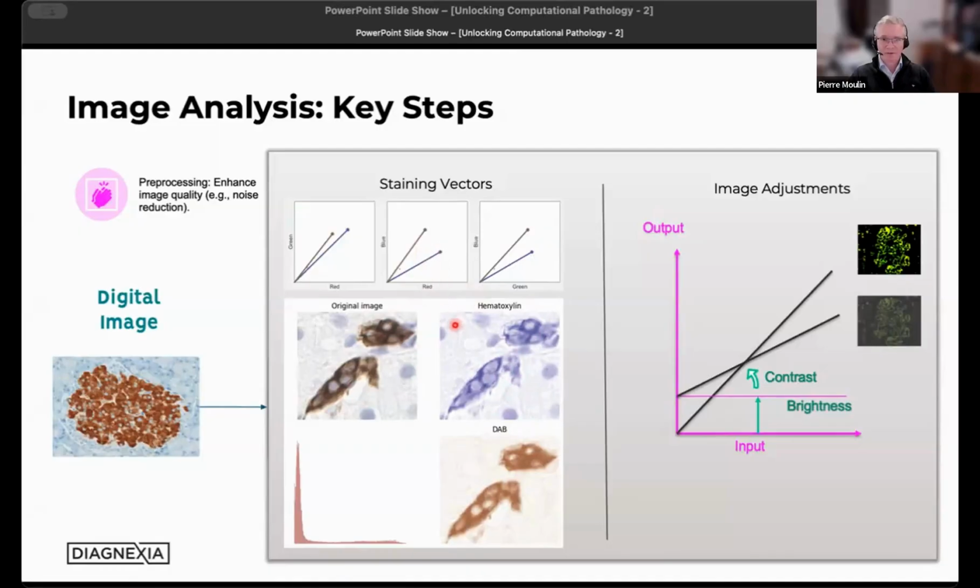It goes a little bit beyond the scope of what we want to discuss today. It's a bit complex, but know that there is an influence here. And it also depends on the characteristics of your stains. If your hematoxylin is a bit grayish, or if your DAB is reinforced with osmium tetroxide, for instance, they will look different. And so we need to take this into account.